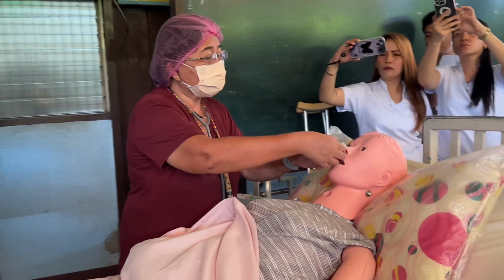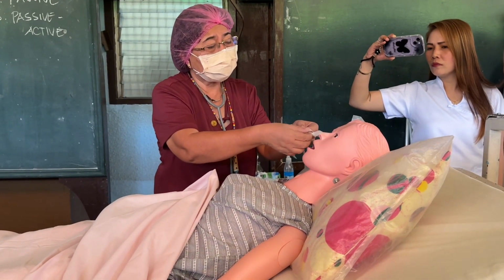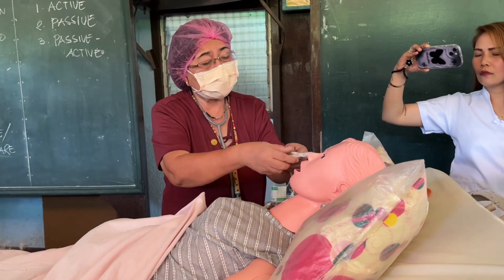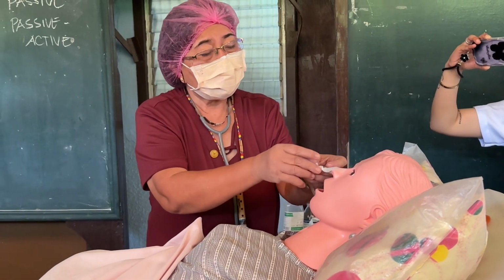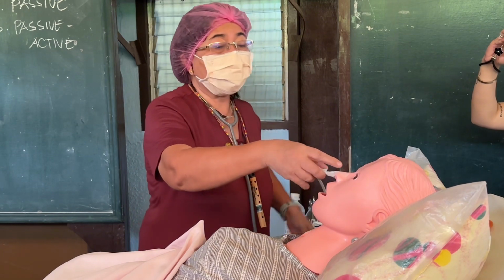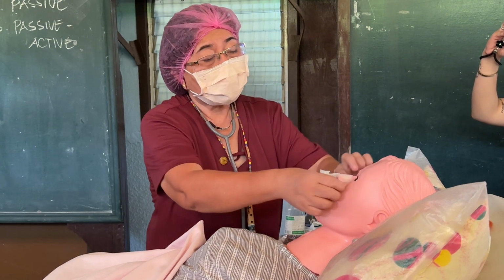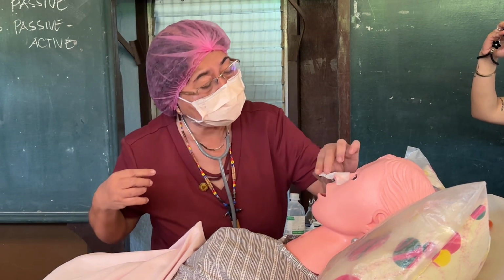Then, each side of the split end should be what? Entwined. Entwined to the tube. So it goes like this, one side going one way and the other to the other side. Okay? It should be entwined, so fix it. Then, reinforce the plaster at the bridge of the nose with another tape, at the bridge of the nose again. Okay. You check that it is not an obstruction to the nostril.